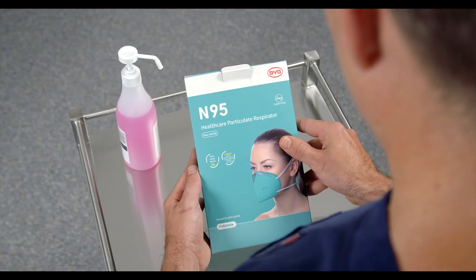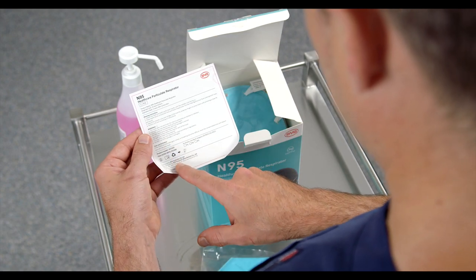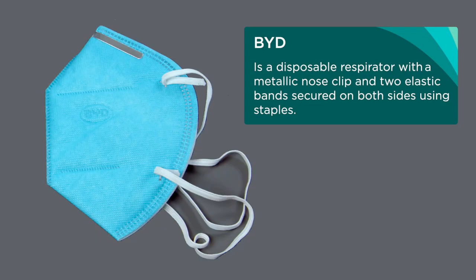This video does not replace the need to check the manufacturer's instruction for use. The foldable N95 particulate respirator, for example BYD, is a disposable respirator with a metallic nose clip and two elastic bands secured on both sides using staples.